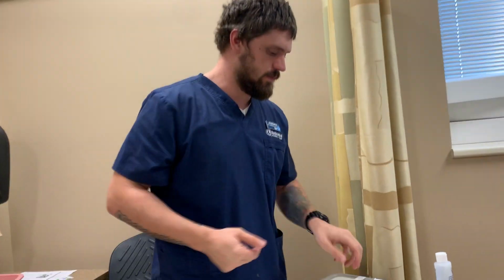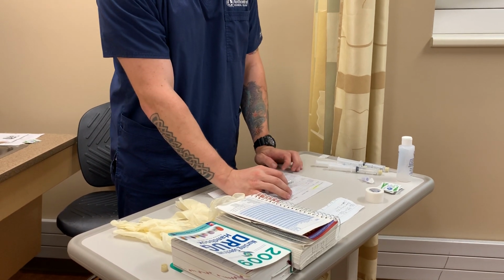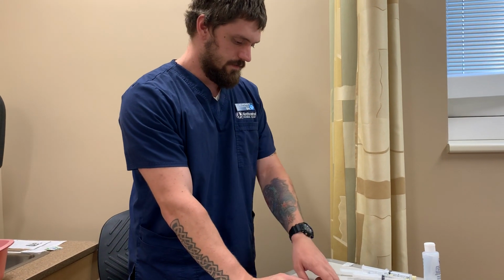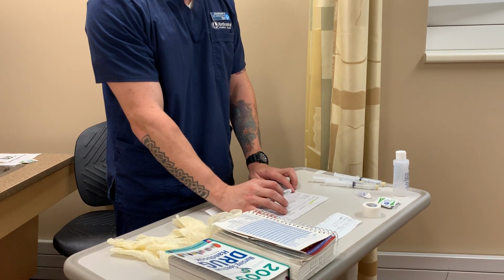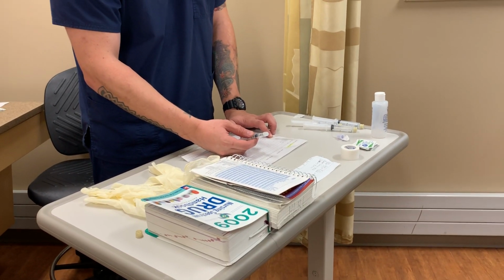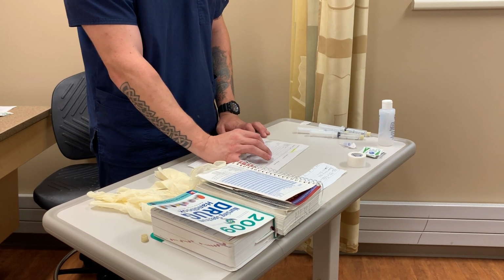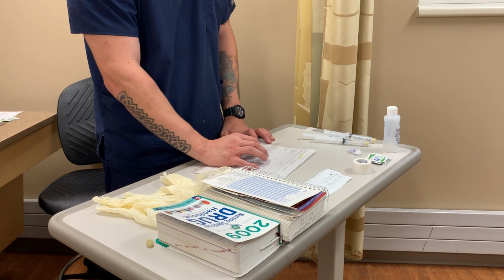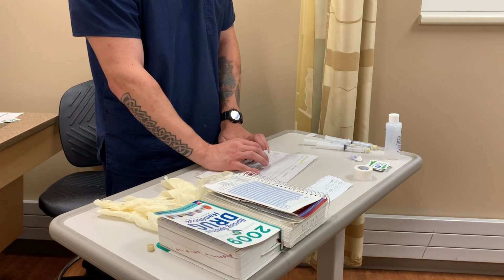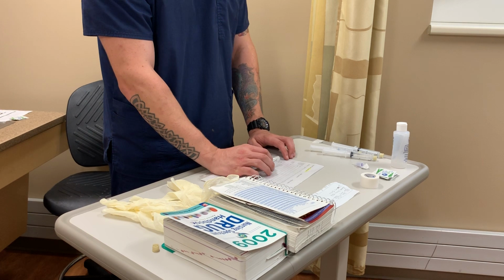So now that we are dose accurate, we are going to do our 3 med checks. So we have morphine sulfate, 7 milligrams, IV push every 3 hours, PRN for Jennifer Doe. We have morphine sulfate, 10 milligrams per 2 milliliters, which equals 1.4 milliliters per dose for Jennifer Doe. Morphine, 7 milligrams, IV push every 3 hours for pain for Jennifer Doe. We have morphine sulfate, 10 milligrams per 2 milliliters, which equals 1.4 milliliters per dose for Jennifer Doe.